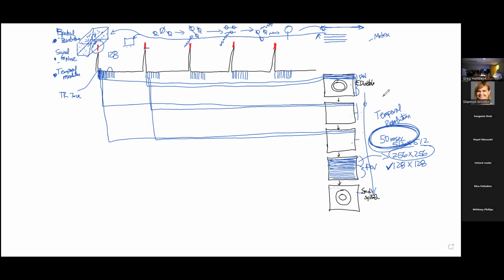You think about the cath lab, we get one frame, piece of information with the delivery of the x-rays and then collecting it. You're kind of getting the whole frame at one time, right? Now, that's great if we have a heart rate of 60 beats per minute.